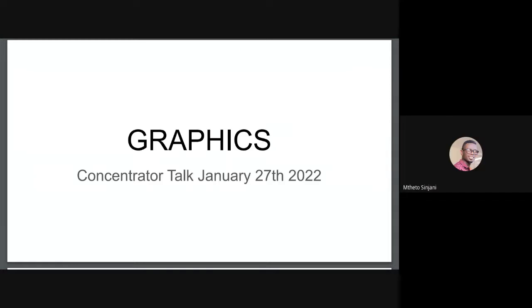As a refresher, for those who may not be aware, zeolite is a chemical used in oxygen concentrators to remove nitrogen from room air, leaving the oxygen and a few inert gases. This process is called pressure swing adsorption. There are different types of zeolite, so be careful, as some types might look physically the same but are different. There's sodium-based zeolite, also called 13X, which is the one you have. This type is considered low-price zeolite, and the performance is okay, but it might not work in all models of concentrators, especially those with high flow.